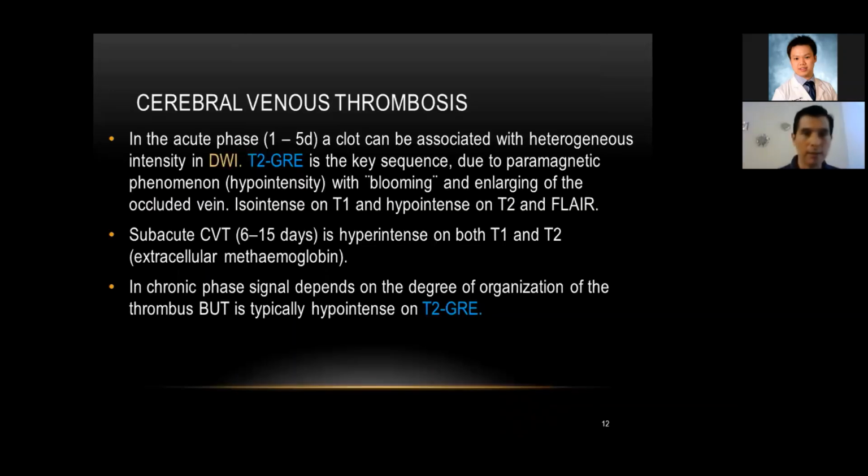In case of cerebral venous thrombosis, as you know the aging of blood, you can apply this knowledge in this kind of aggregation of red blood cell that is a thrombus, but with some difference, because in case of thrombosis, you don't have the final phenomenon, that is the deposits of hemosiderin in macrophages, but the other stages of the sequence could be very similar.